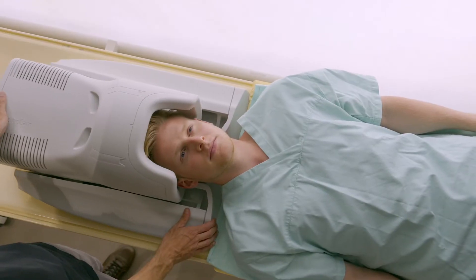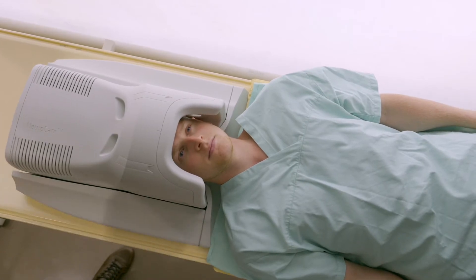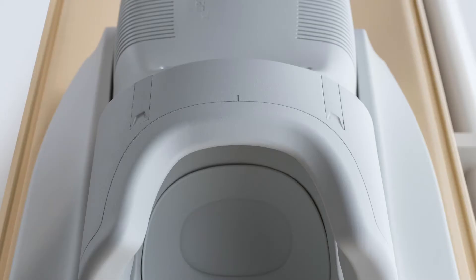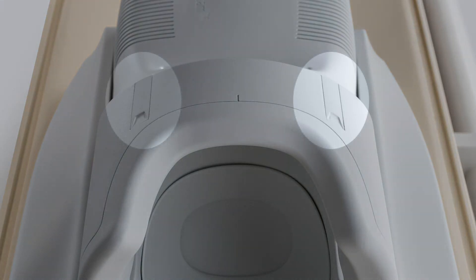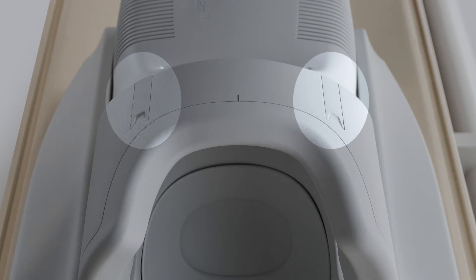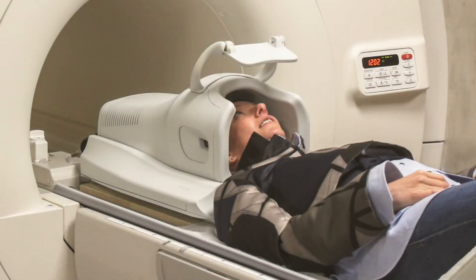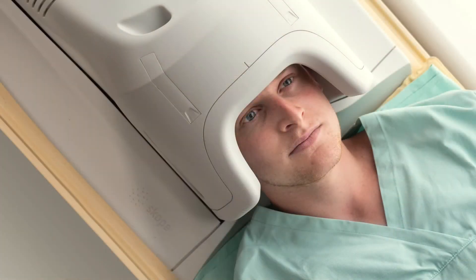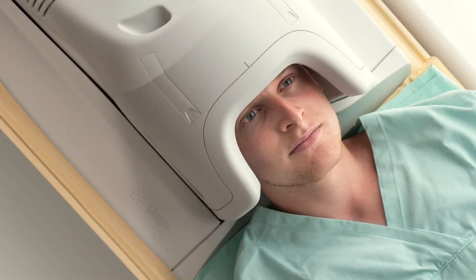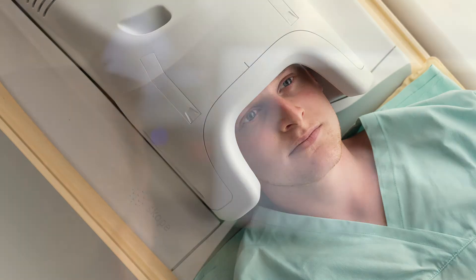The NeuroCam has a wider visual field open to the subject. The provided mounting rails are compatible with third-party eye trackers and other experiment-specific hardware, allowing for a wide range of fMRI experiments to be performed. Alternatively, the visual field can be left open, allowing the subject additional comfort.